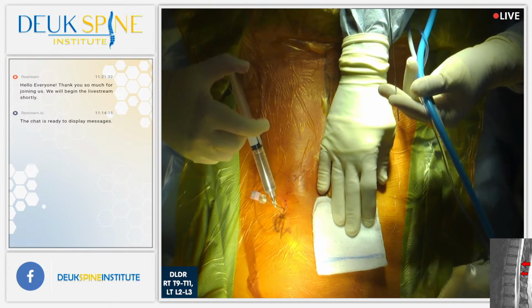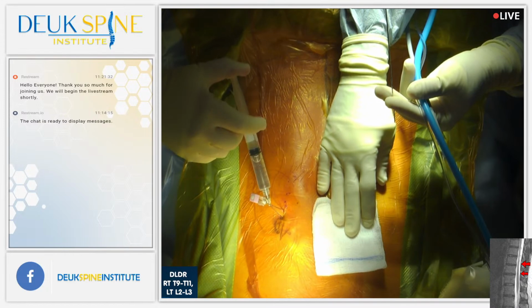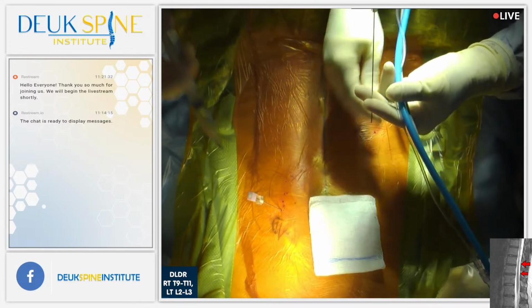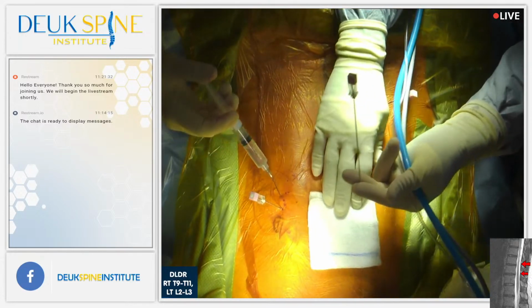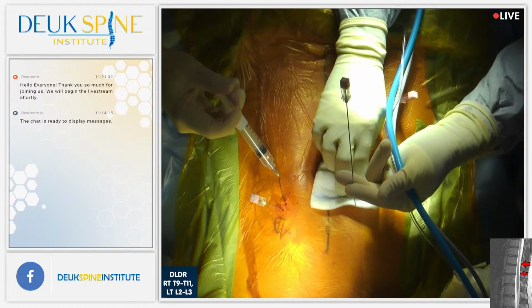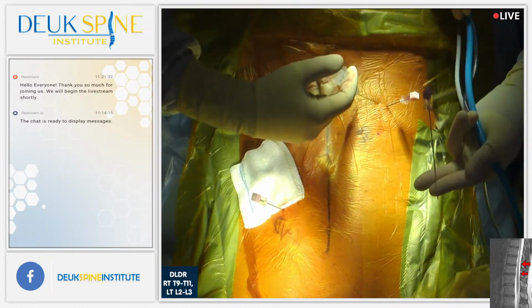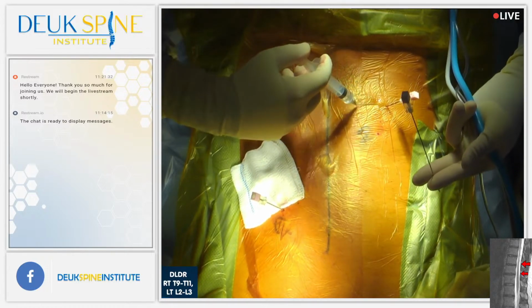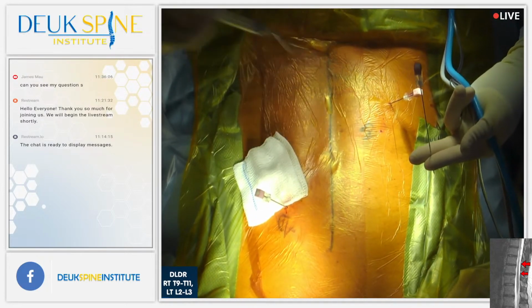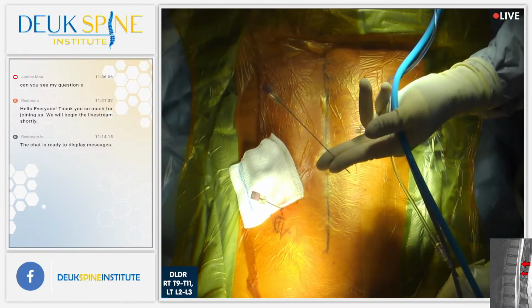Why are discs painful? We're just giving you some numbing medicine. And we're going to need them awake in less than 10 minutes once I get this final needle in. A little more numbing medicine, that's all. Okay. So, Henry, let's show our audience why people get pain in their back from a herniated disc. I'm just giving you some more numbing medicine. All right.